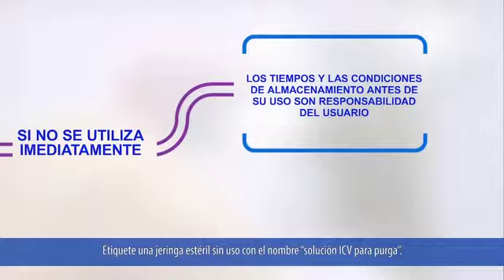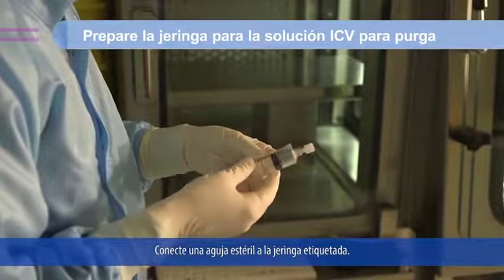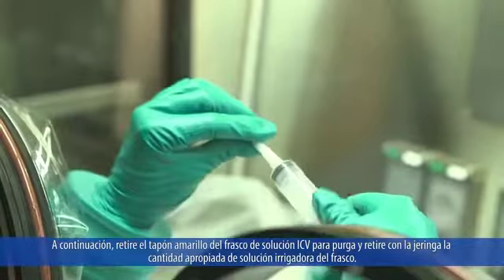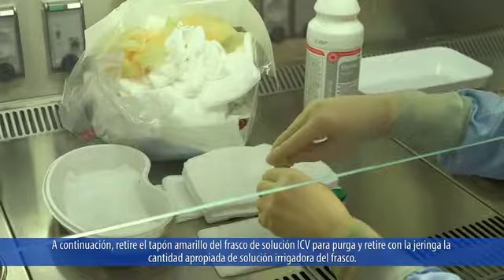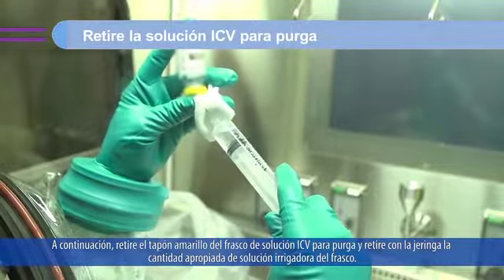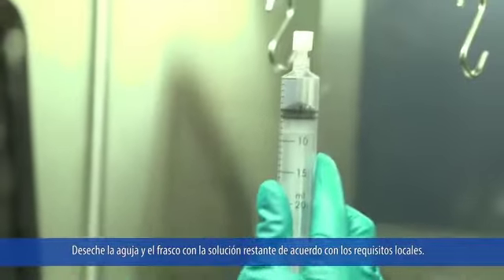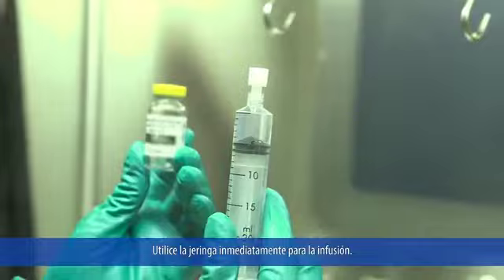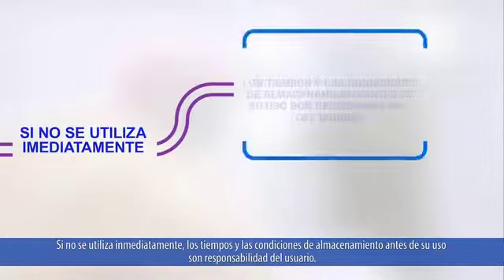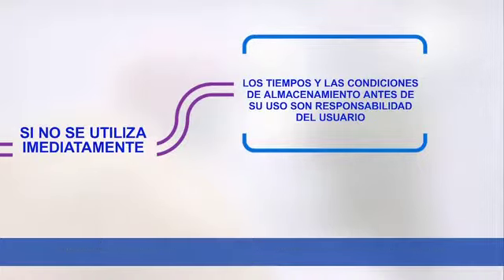Label an unused sterile syringe for the flushing solution. Attach a single-use syringe needle to the labeled syringe. Remove the yellow flip-off cap from the flushing solution vial and withdraw the appropriate amount of flushing solution from the vial into the syringe. Discard the needle and the vial with the remaining solution as per local requirements. Use the syringe immediately for infusion. If not used immediately, in-use storage times and conditions prior to use are the responsibility of the user.